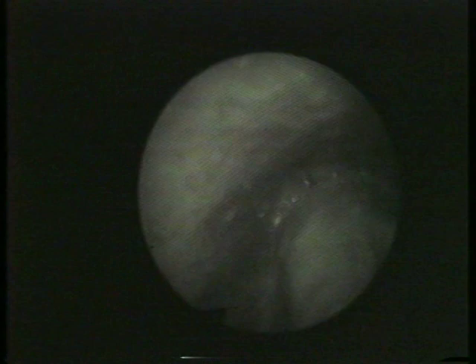Strobe on you for a while. At this point, Dr. Kirkham is attaching a strobe light to the end of the endoscope. The flashing light permits us to see the vibration of the vocal folds in slow motion.